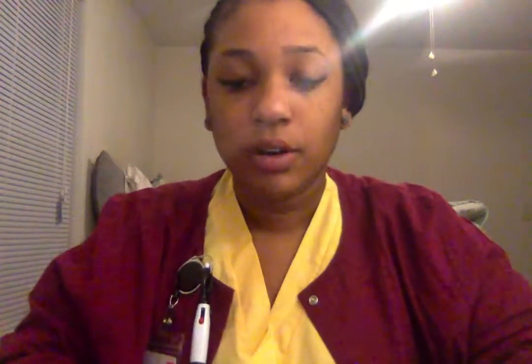So I would have done this in the medication room, but like I said, I want to check the expiration date for my medication. Also check the expiration date for the syringe that I've used. And we're using a TB syringe, so we know that it is within range and within expiration date. So this one's okay. Now I'm going to ask my patient which arm they would like me to use for their TB test today. And whenever I give that TB test, I want to make sure that it is in the forearm area so that we can properly give it.